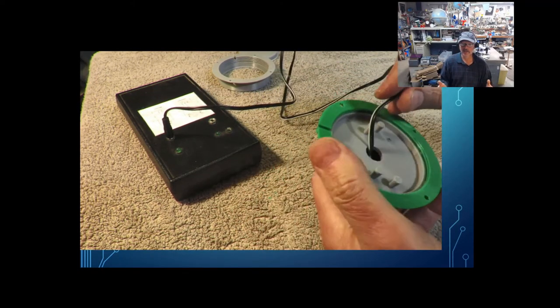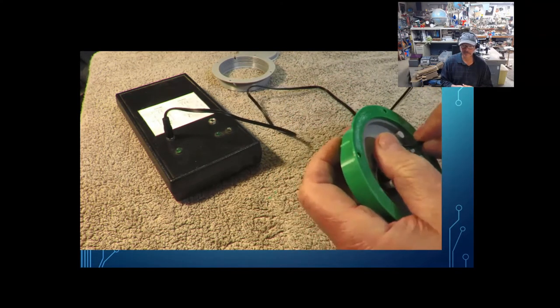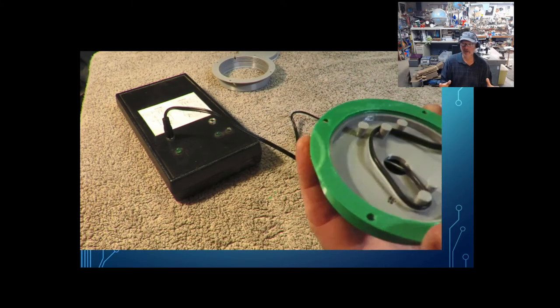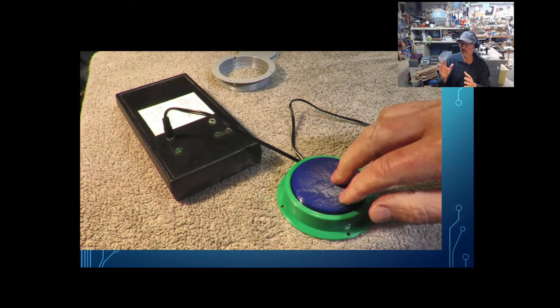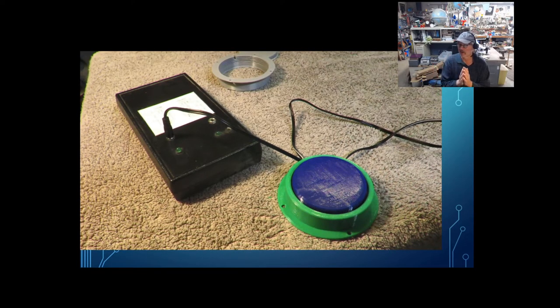Get your hot glue back again and wrap the wires around those little pegs in the bottom there. And again, a minimum amount of hot glue just to hold the wires in place. What might be good too is to either use the four holes I had there to mount this to something, or to put Velcro on the bottom just to keep little fingers out of the bottom there too. But it's pretty resilient even if you don't do anything to it.